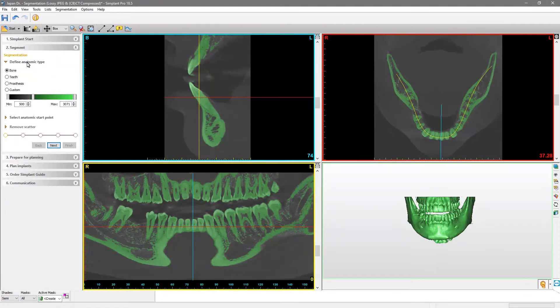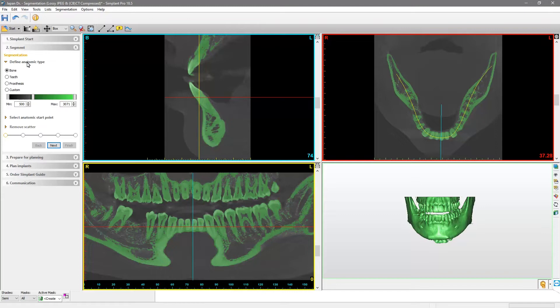We are looking for a good compromise between the accuracy of the anatomy and the amount of artifacts. In order to find it, please check the axial and cross-sectional images to verify that the bone is fully colored.